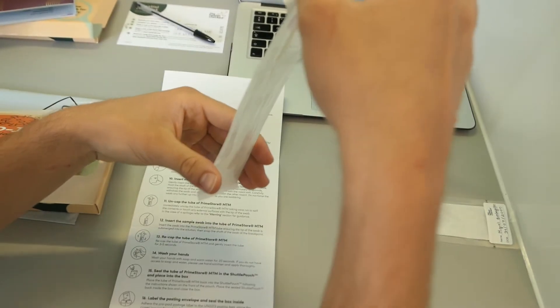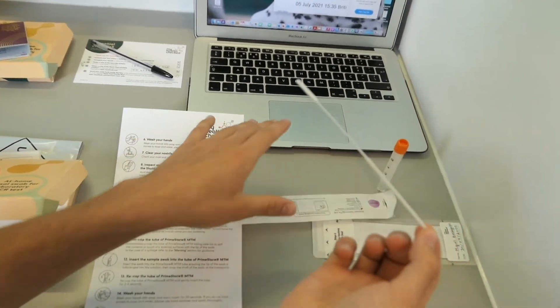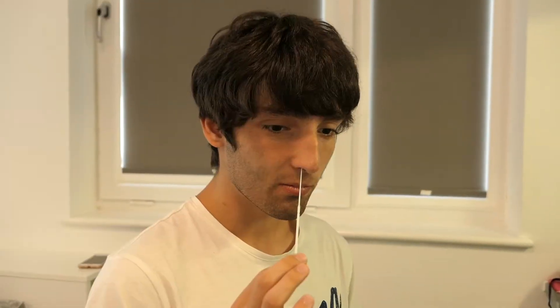Then, carefully remove the swab from the packaging, ensuring the tip of the swab does not touch any external surfaces.